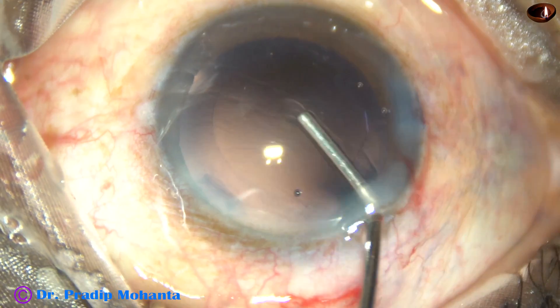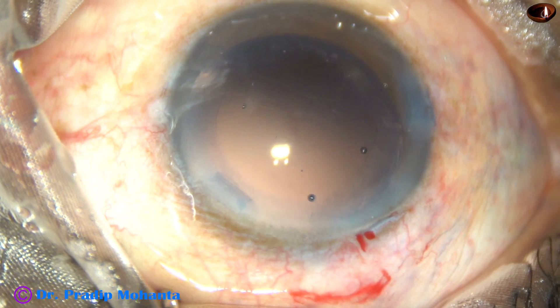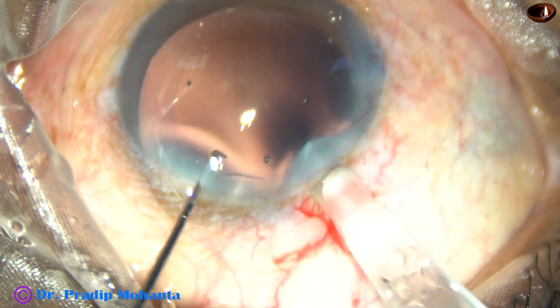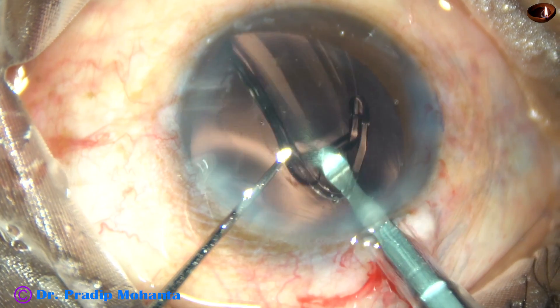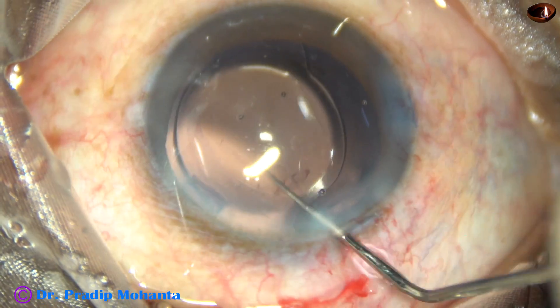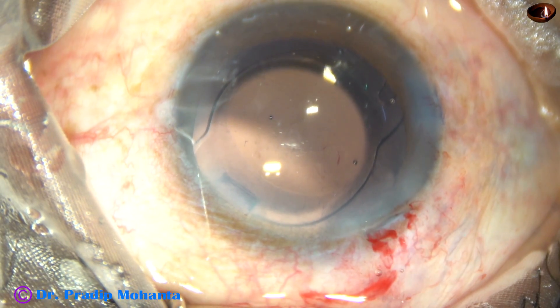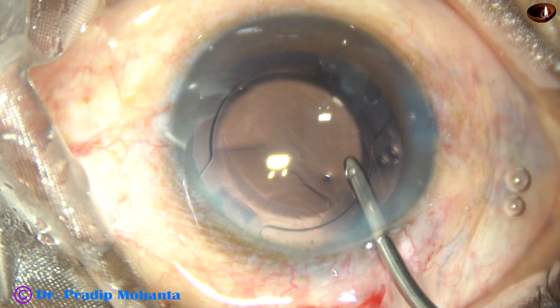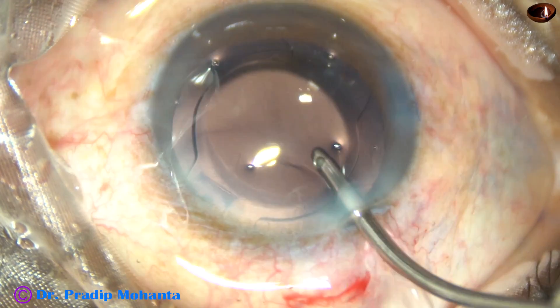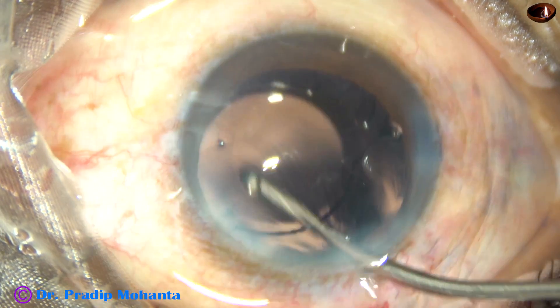Viscoelastic substance is injected to fill out the anterior chamber and inflate the capsular bag. Now this is a hydrophilic acrylic intraocular lens going into the capsular bag. If it doesn't go into the capsular bag in one shot, use your Sinskey hook — go through the right side port, or left side port if your dominant hand is left — and then place the lens in the bag. Now irrigate out whatever viscoelastic substance remains with the irrigating probe of bimanual I/A. Go behind the lens and irrigate the capsular bag.